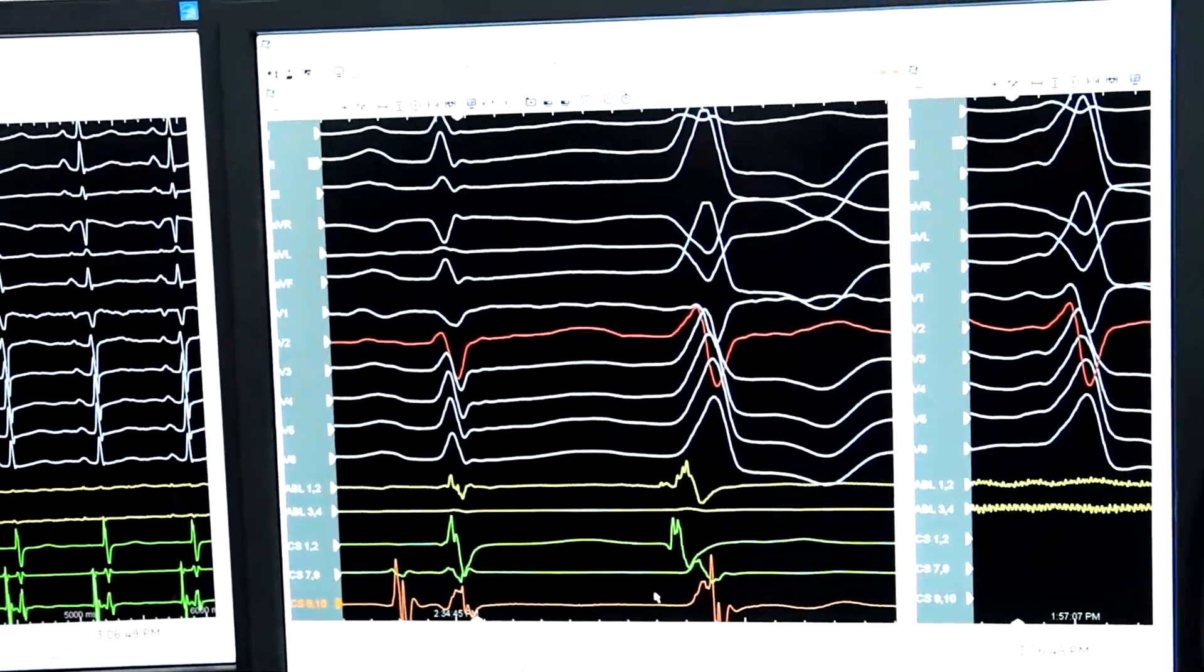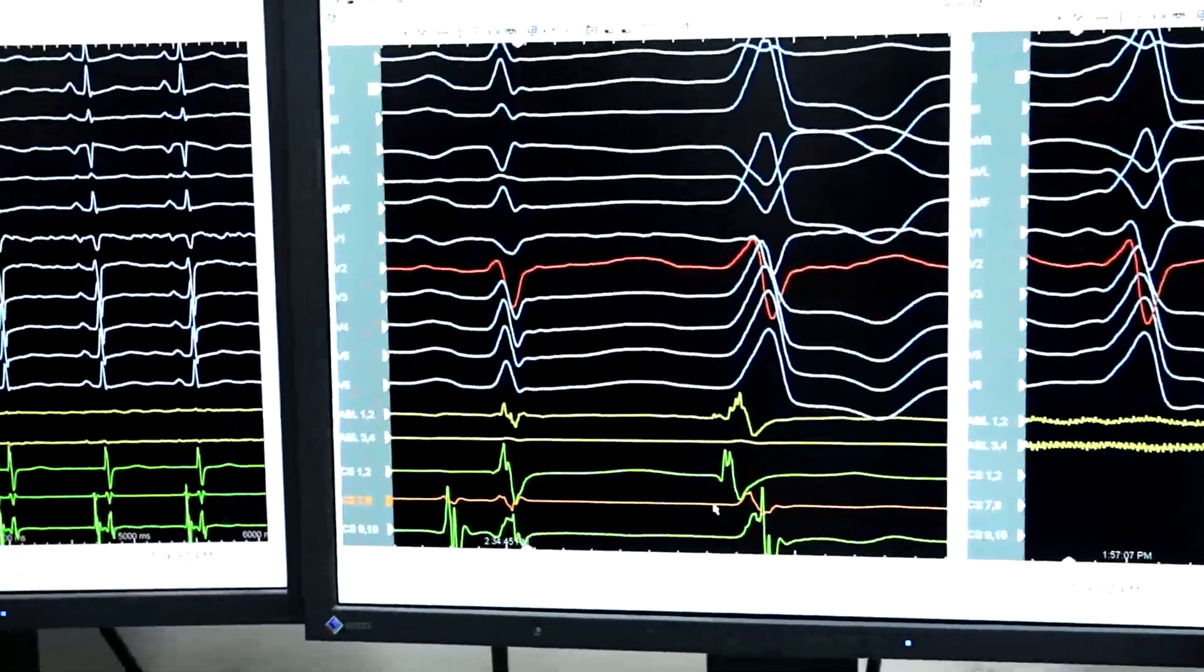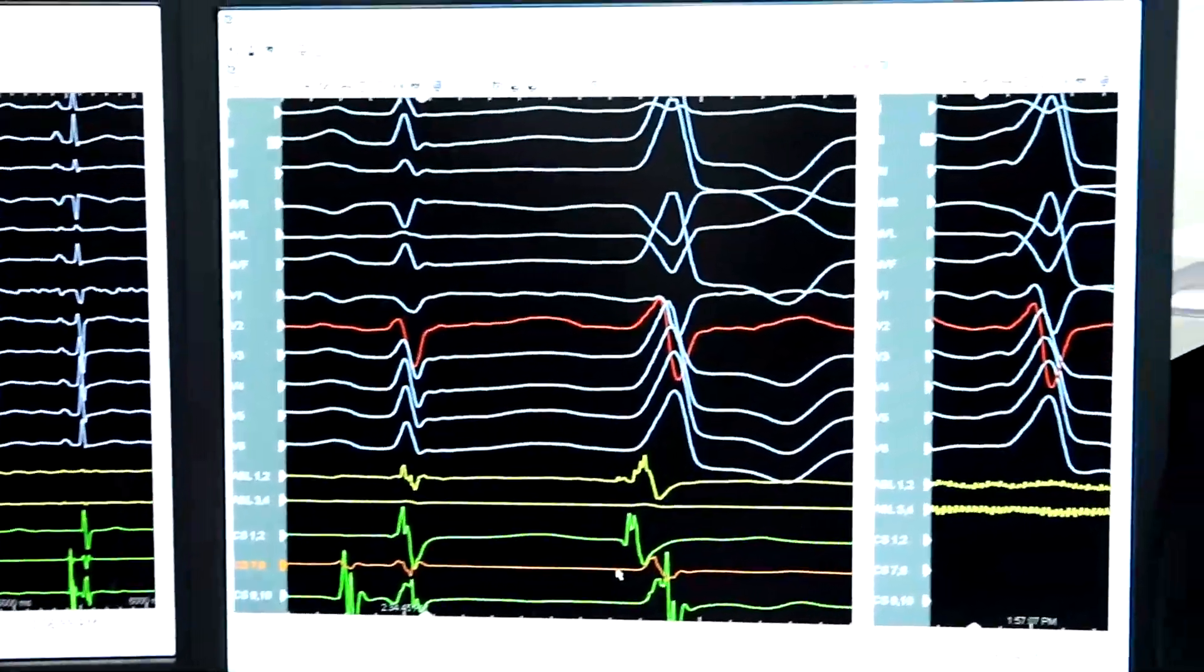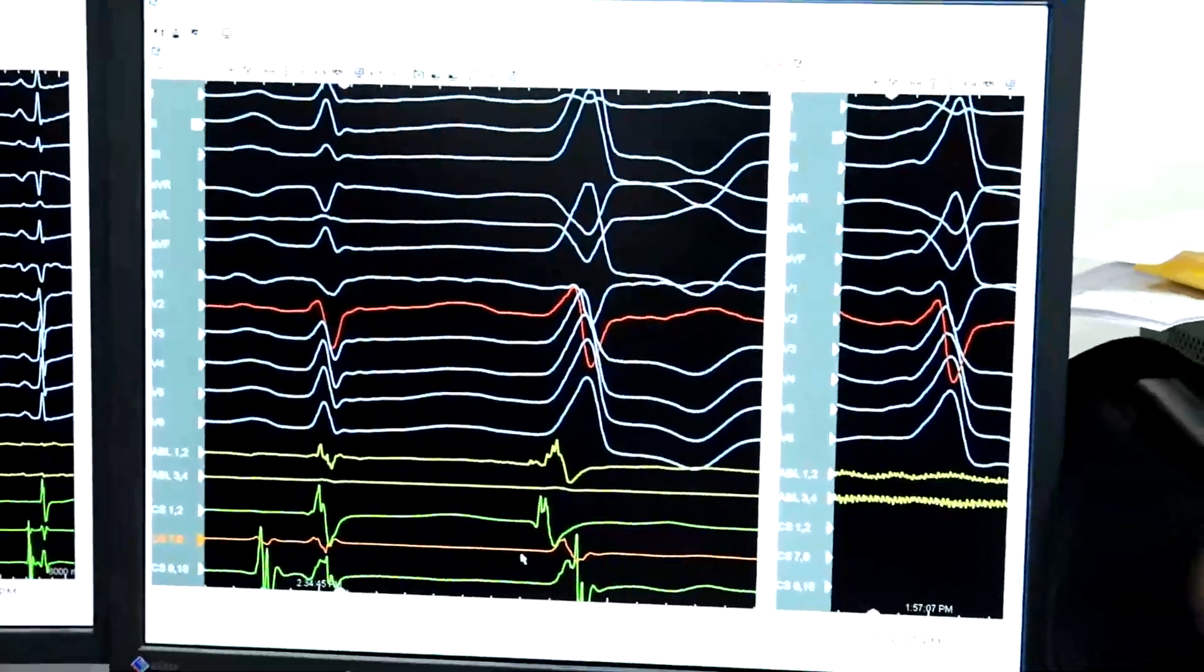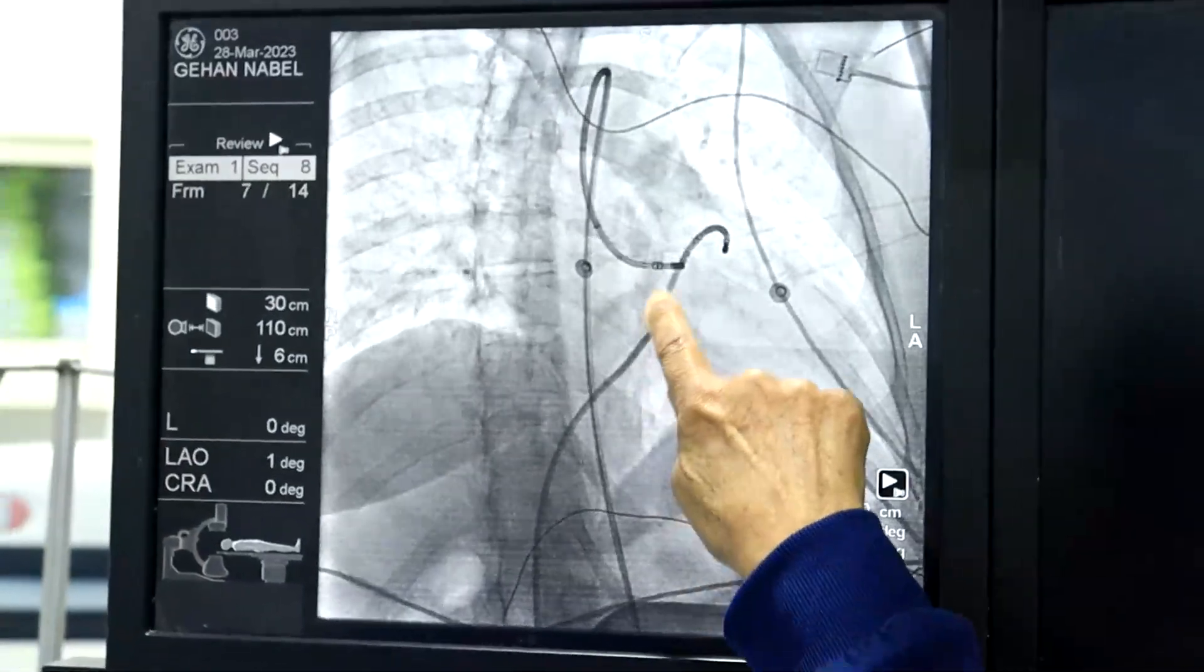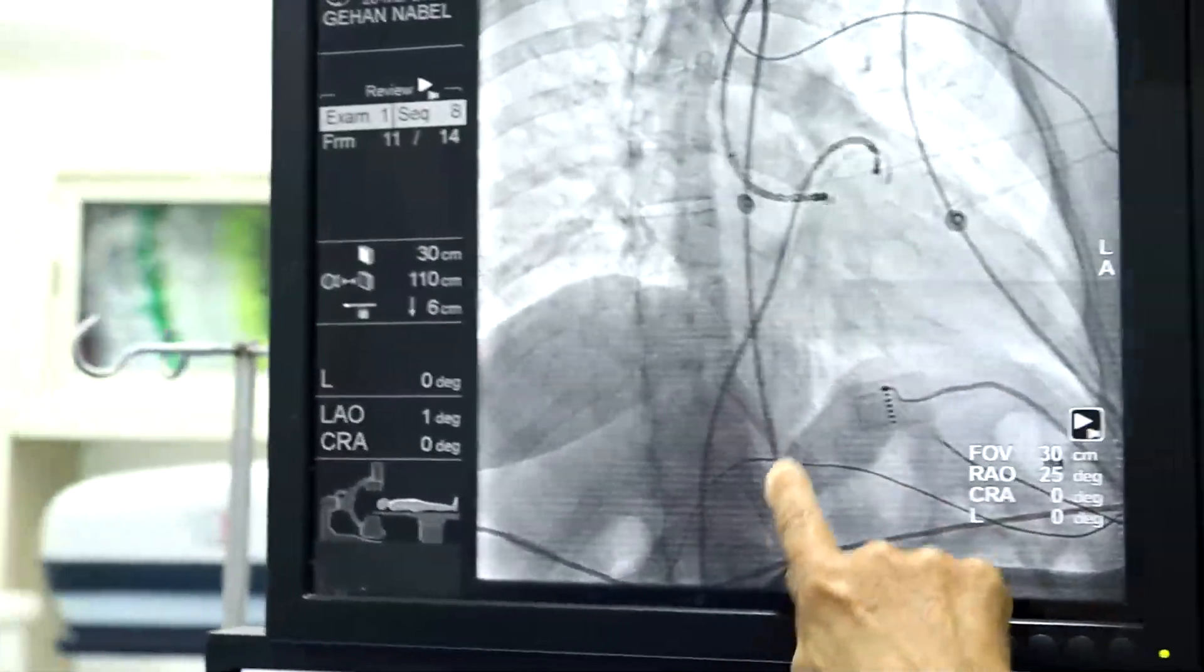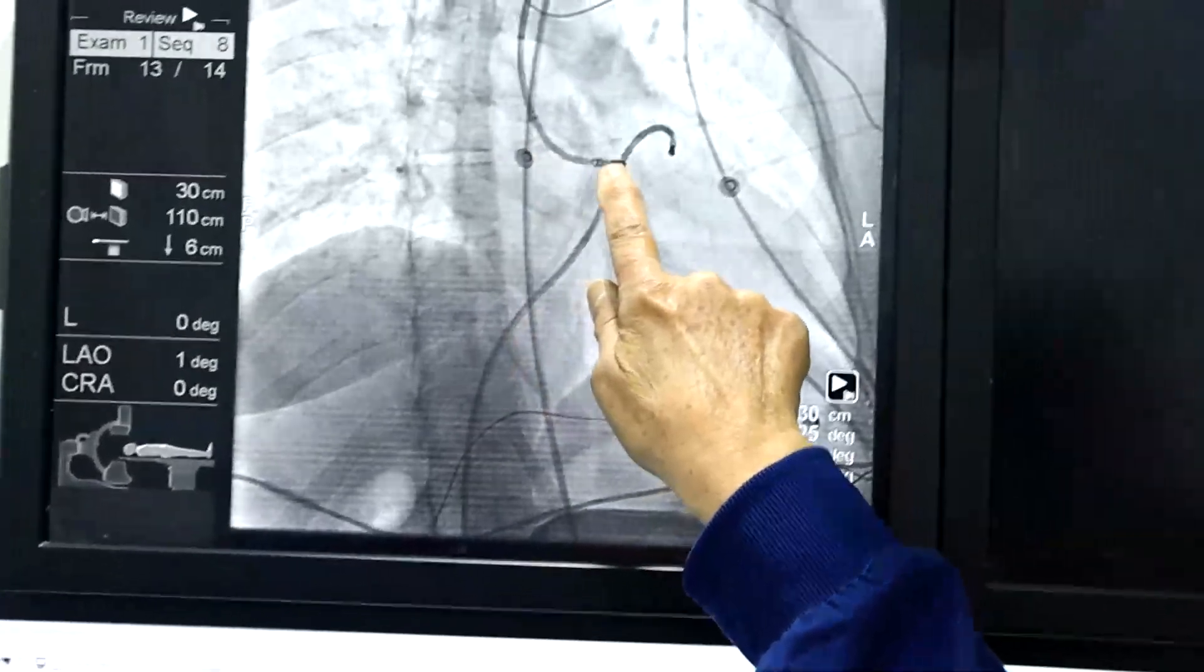Salah introduced the CS. John went into the coronary cusp. Salah, you introduced it. Why did you introduce the CS catheter? To dip into the CS. And as a fluoro you can see here that the CS is highly introduced into the anterior interventricular vein. And then this is the retrograde aorta approach.